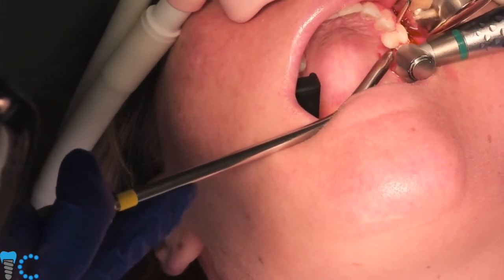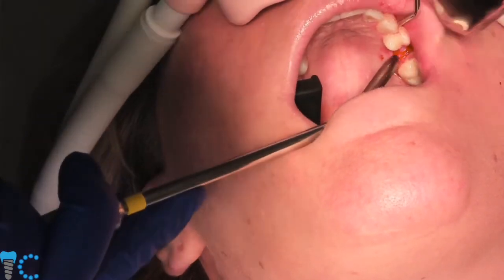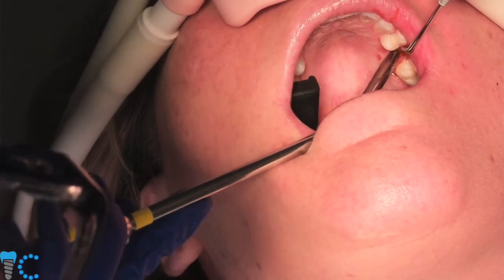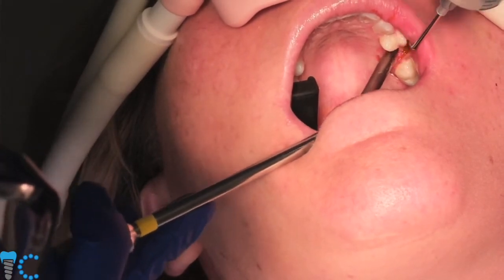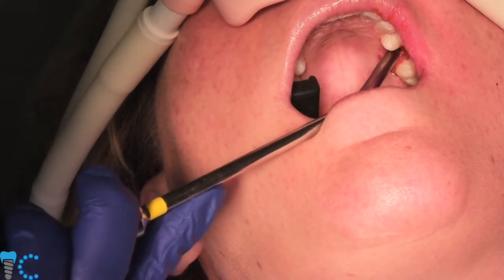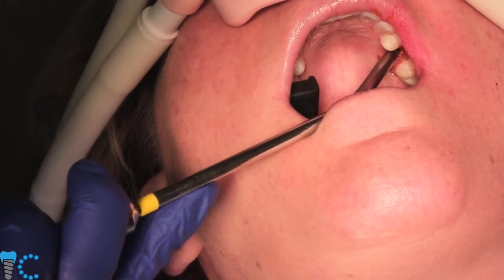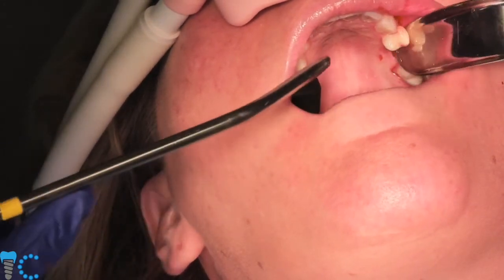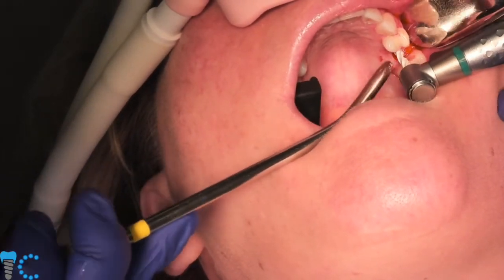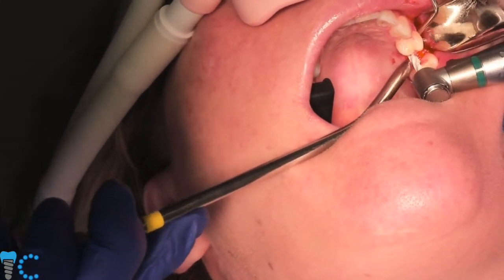So even though we're placing a 10 millimeter implant, we saw that we actually have a little extra vertical space. As I'm drilling, I always like to clean off these drills. I like to keep everything on our tray clean. I like to keep the drills clean. If we're doing an immediate extraction, the tooth never goes onto our surgical setup. It goes in the trash, biological waste. But we don't do anything to contaminate our tray to the best of our ability.